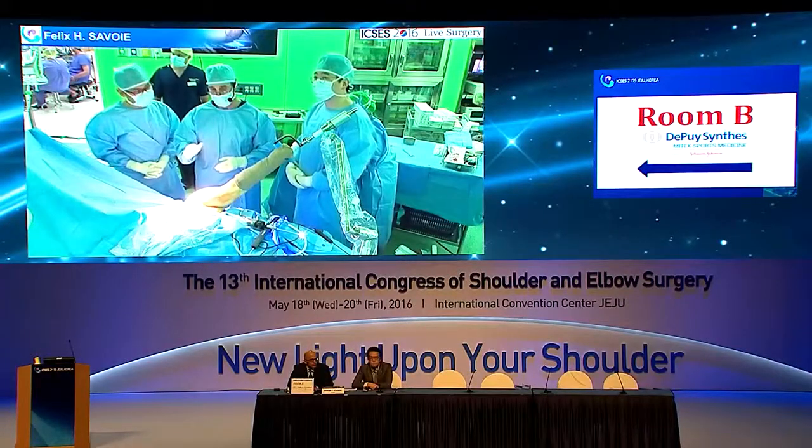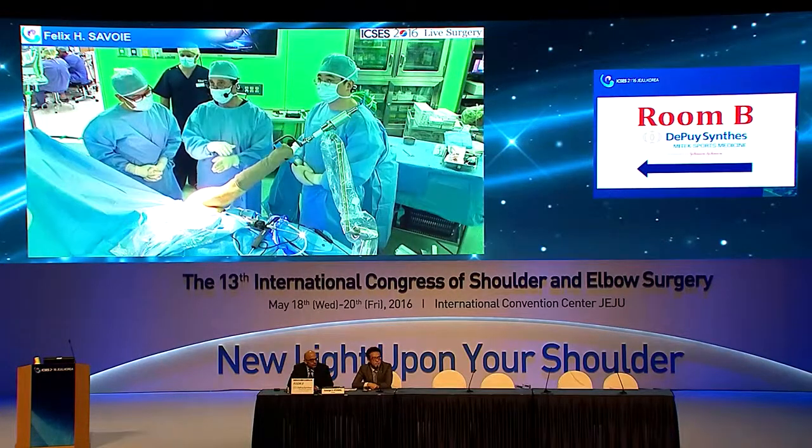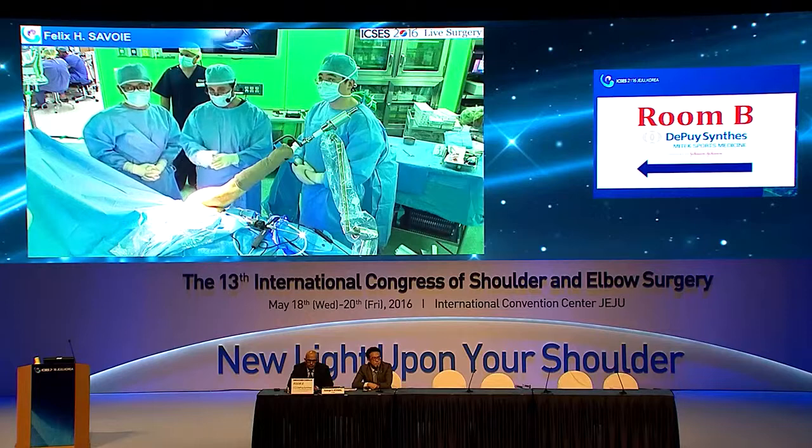I'm not sure I understand what you're asking me. Your question is, is there any role for dual row repair? Double row? Not double row. Dual separate row, medial and lateral? Yeah, so Sugaya thinks that you should repair the undersurface part and the superior part separately. That you should put a bottom one in and repair it.